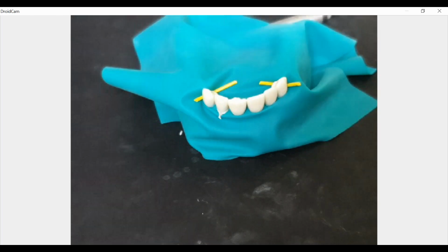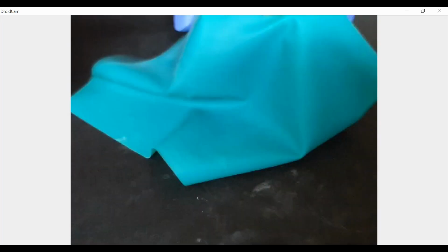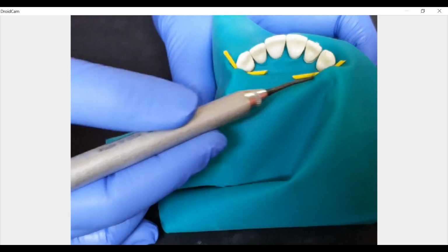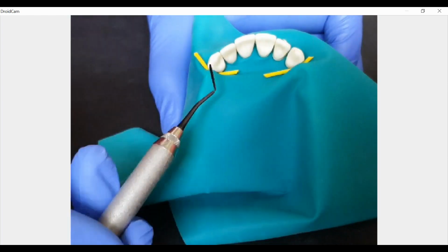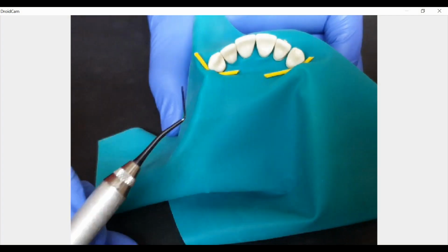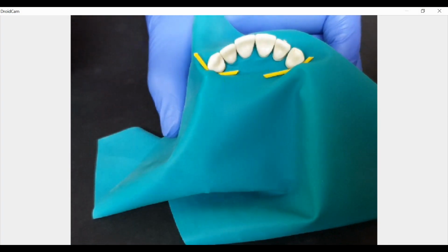Now, what benefit do I have if I isolate multiple teeth? If I have to perform, say, a root canal on just one tooth, say, only on this one. When I have an isolation like this, I have not used any clamp, so I don't have any hindrance to my work. I can use the endomotor, I can use my ultrasonic instruments, I can use my WVC instruments, I can use everything, no problems at all. I can even perform my direct composite restoration simultaneously.